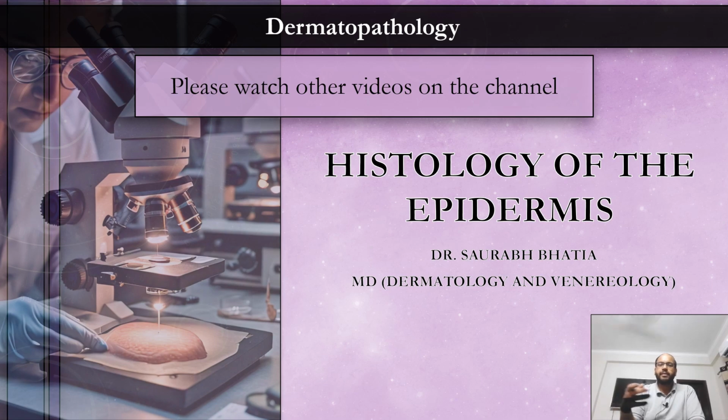And when we see these different appearances in a disorder, along with a lot of different features at the dermo-epidermal junction and the dermis, we take all the findings together in a constellation. We aggregate all those findings that we see in a biopsy, and then we correlate that with the clinical history provided and the clinical picture.